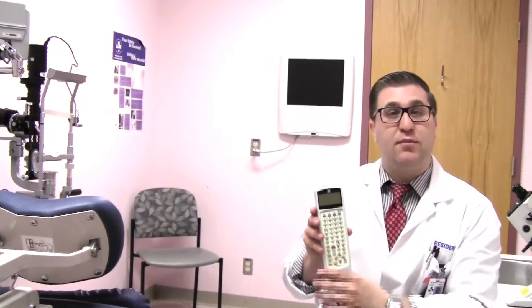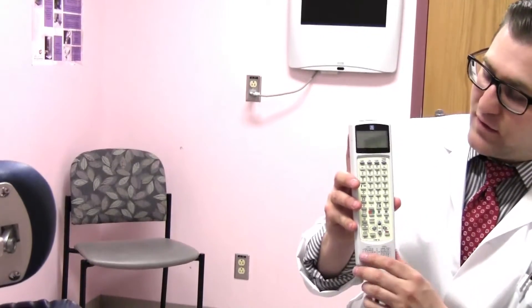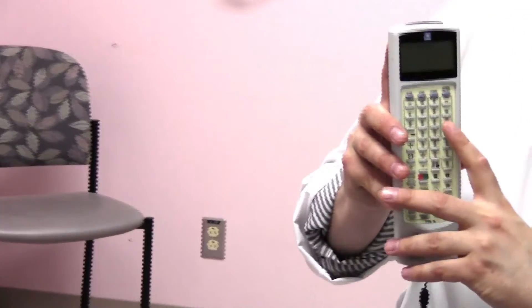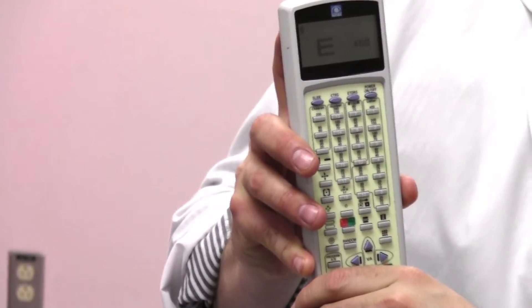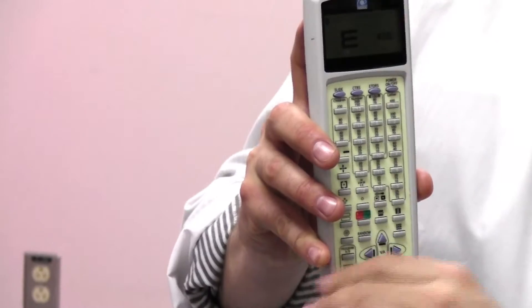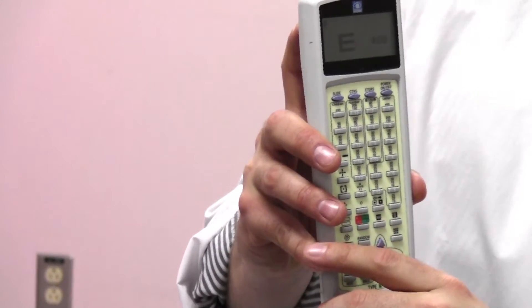First, you want to make sure the patient is sitting comfortably in the chair and facing the screen. Then you want to pick up this remote. Every remote can be different depending on what type of equipment you're using. Keep in mind that different centers will have different equipment and different machines, so you have to adapt to different technology. Today we'll discuss this system here.